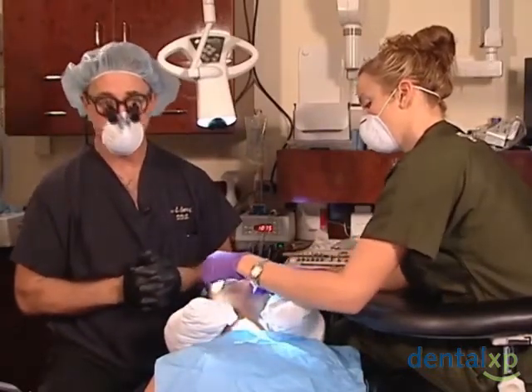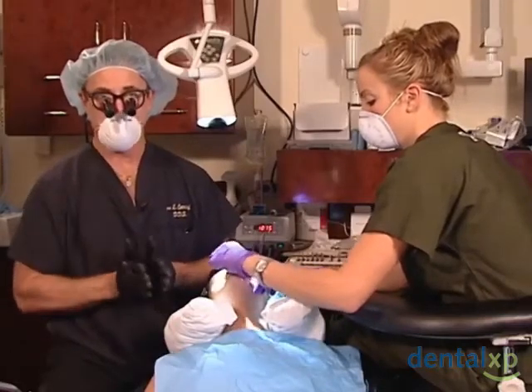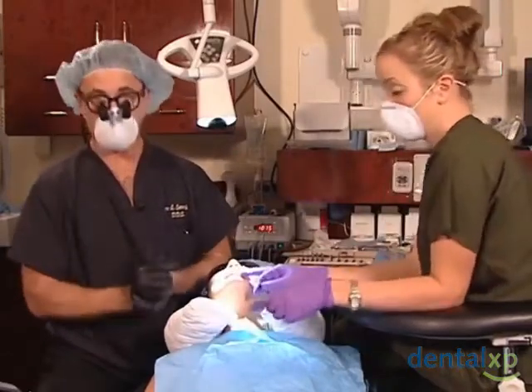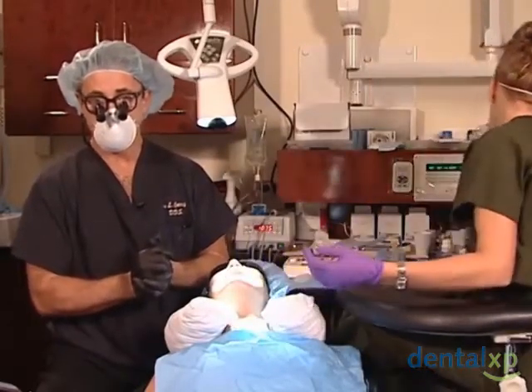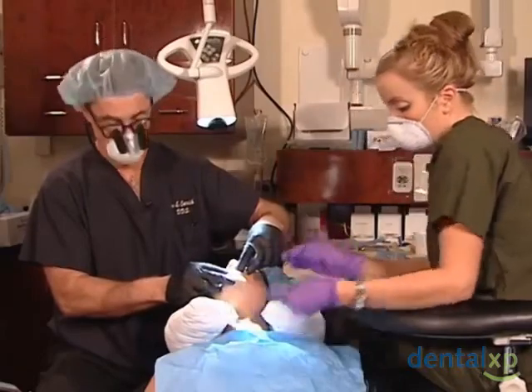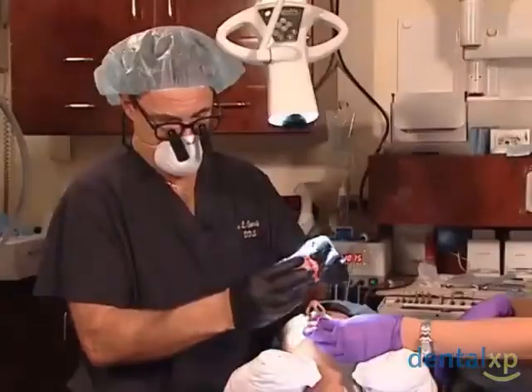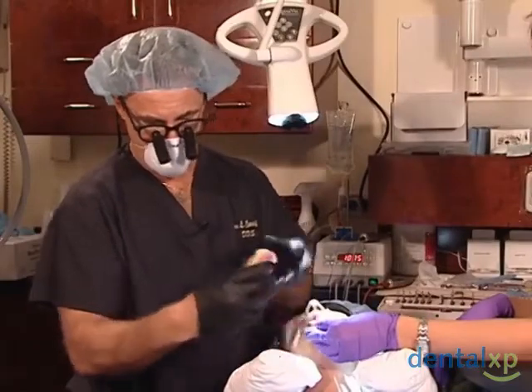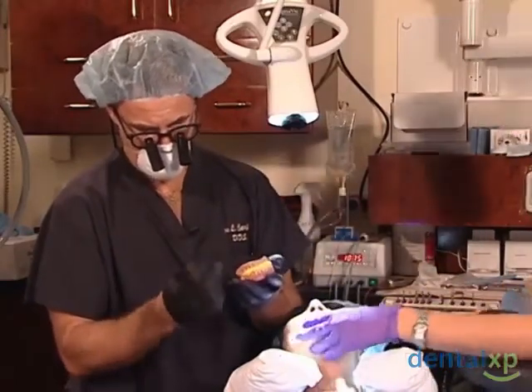I usually don't talk about doing a new denture until I'm able to establish the first thing they came in for — stability — which is why they have a bag of dentures. We're asking a different question and we're going to get a different answer. Be very selective because you have to know where the implants are going so that you have the denture base and teeth over the ridge. We've got our markings — upper, lower — and our denture relation registration. While I'm starting to work on the lower, we're going to have the denture modification done in another room by your assistant, preferably your lab technician.